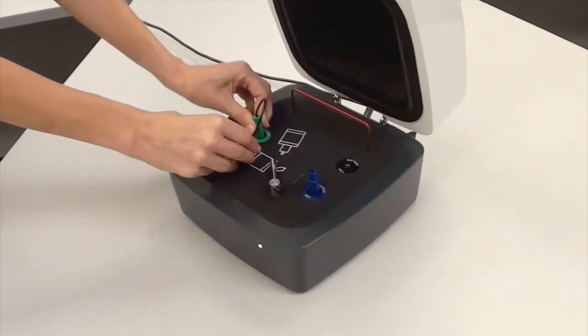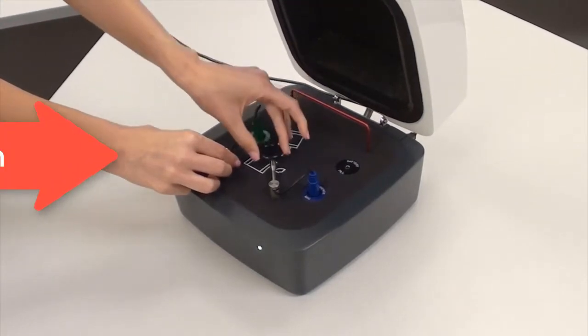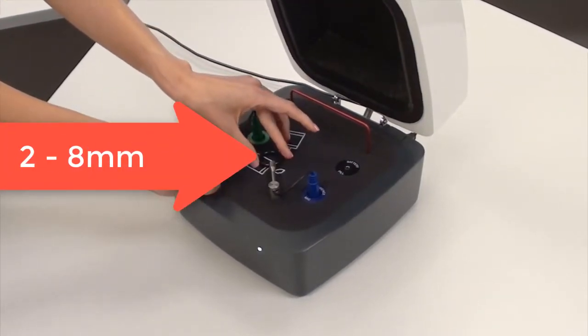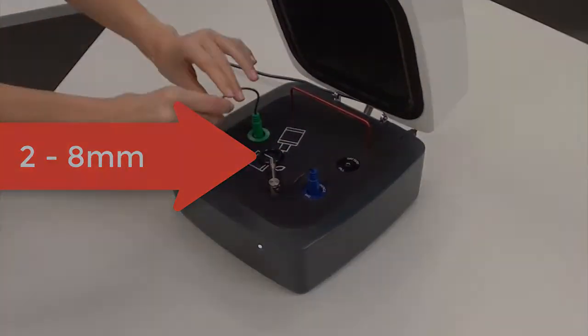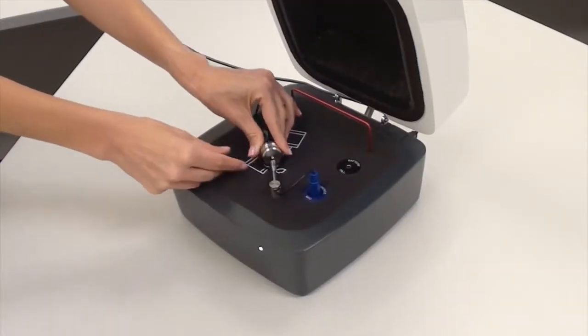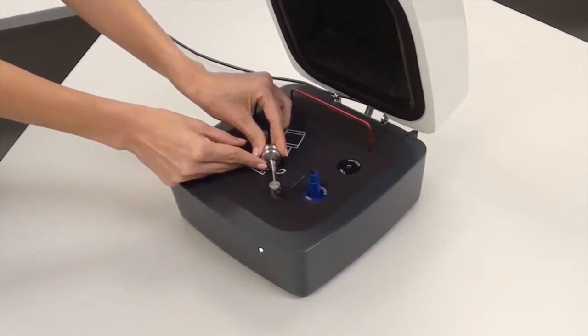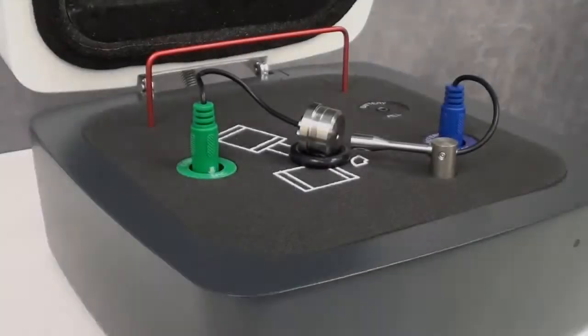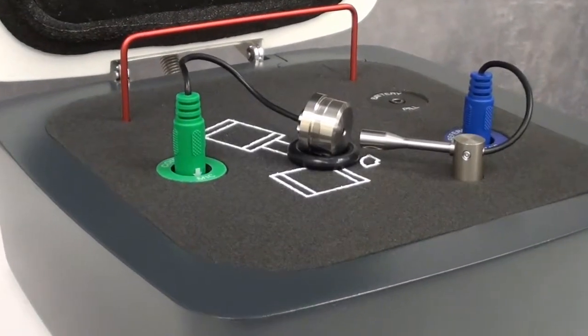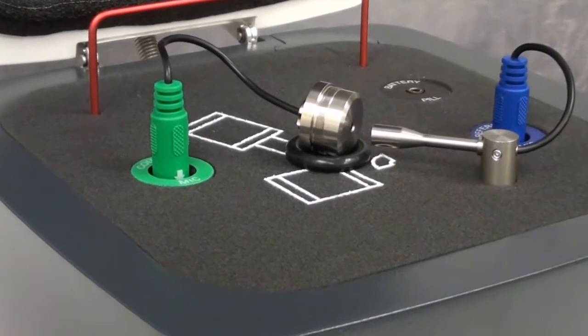Next, place the coupler microphone between 2 and 8 millimeters from the reference microphone. You should raise the coupler microphone to the same level as the reference microphone using the large o-ring that was included in the kit.